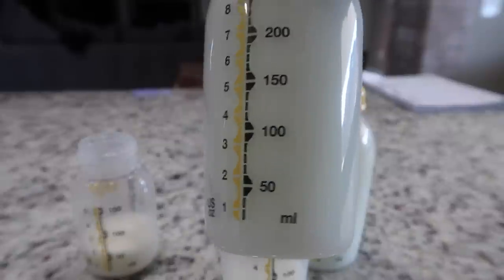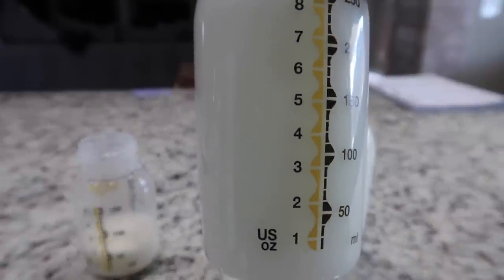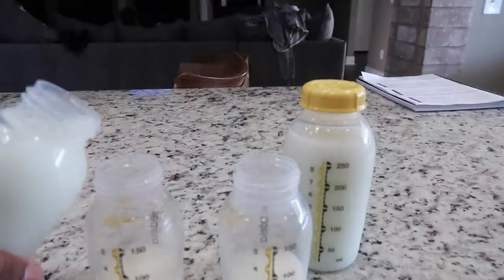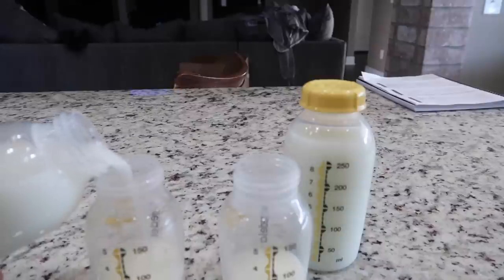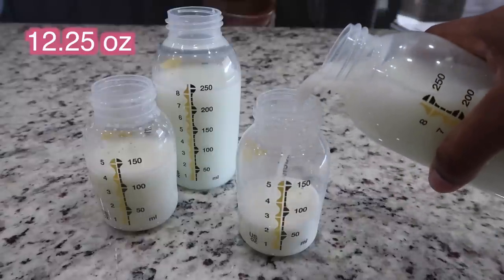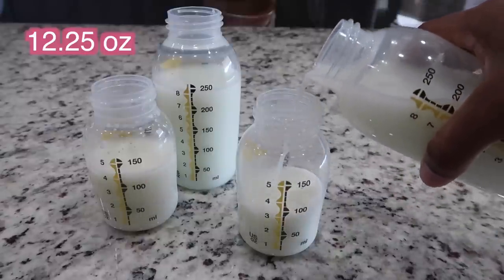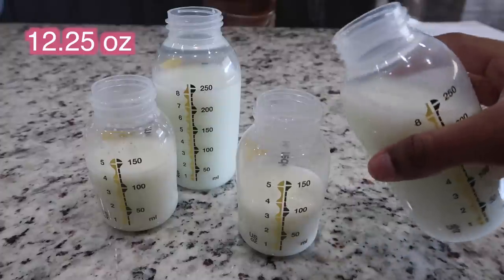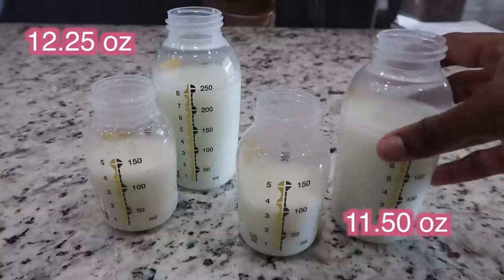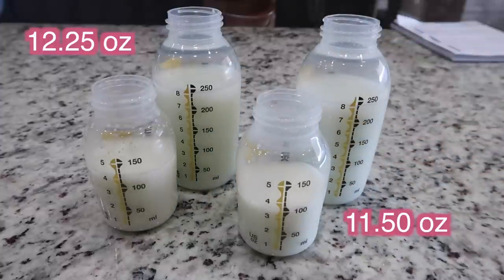Now I'm going to measure it out so I can see how much I pumped. I take the two bottles from the left and two from the right and dump each into the measuring bottles. On the left side we did 12.25 ounces, on the right we did 11.5 ounces — so 11 and a half and 12 and a quarter. Not bad at all. That's legit — that's enough for about four feedings.